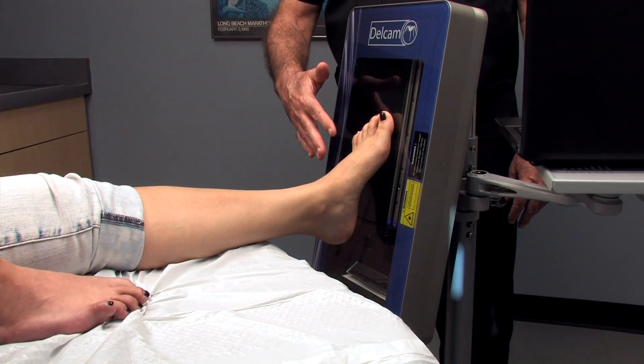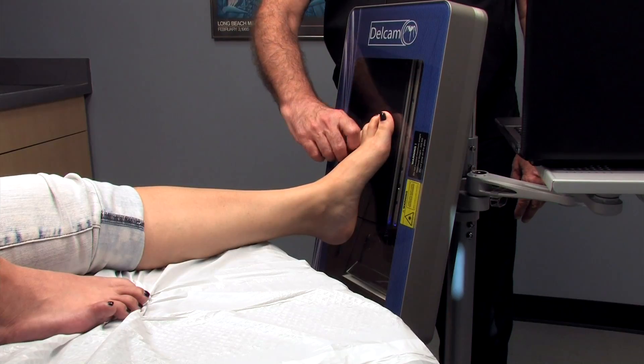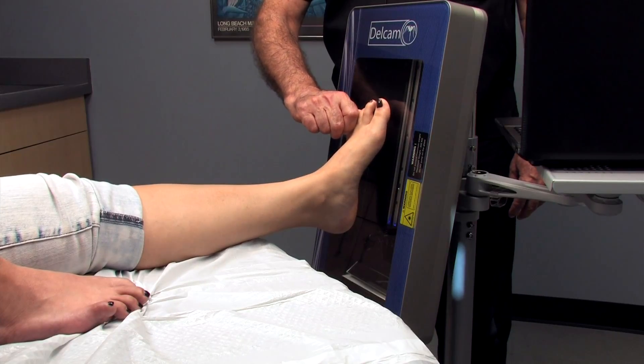The advantage of this scanner compared to other scanners is we can lift the foot and lock the mid-tarsal joint, and that's really essential to get a properly functioning foot orthosis.